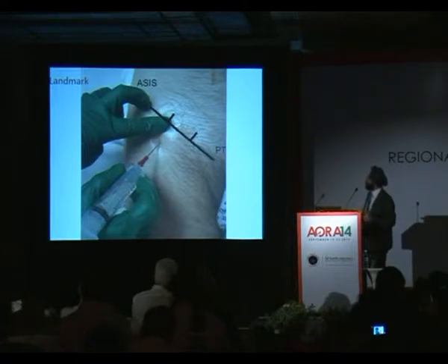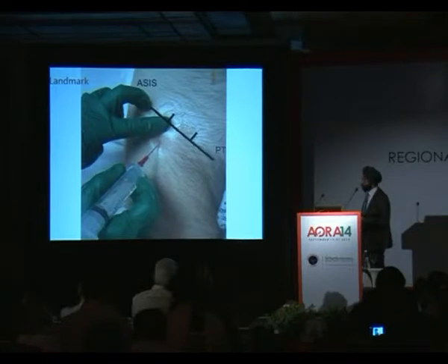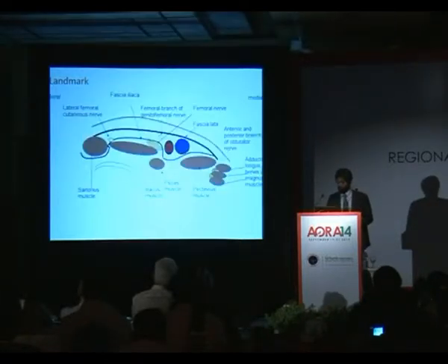I would enter the skin at a right angle, and once you have pierced the skin, you just change the angle to about 50 to 60 degrees. The first pop you feel is your fascia lata, and the second pop you feel is the fascia iliaca. So it's basically a two-pop technique.